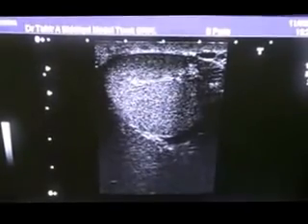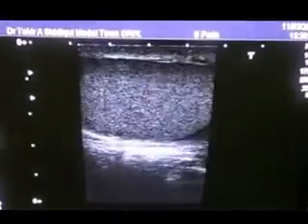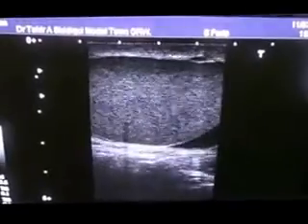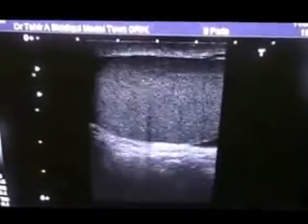It is said that if we can see the mediastinum testis, the testis is considered to be normal. The left testis is showing normal size, normal low-level echoes, no focal lesion, and no significant calcification seen within it. And the epididymis is normal.